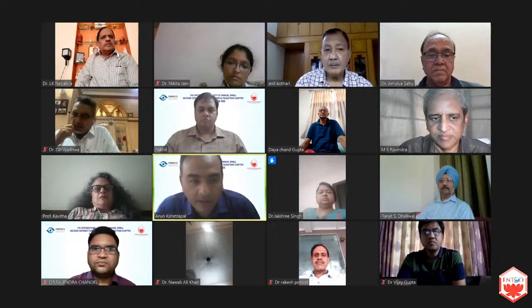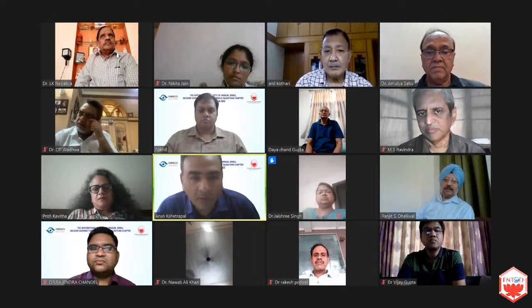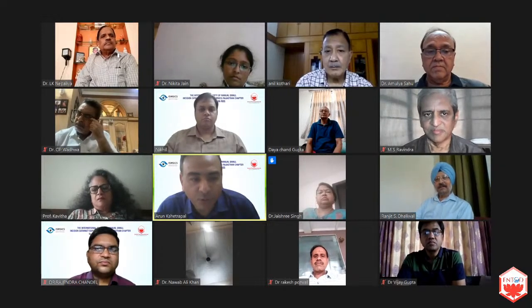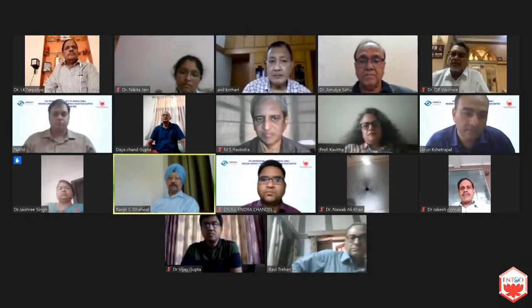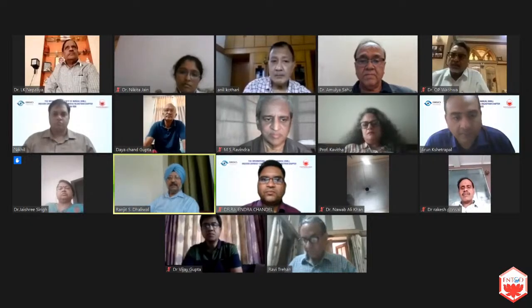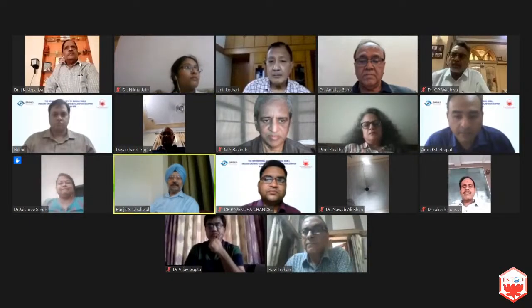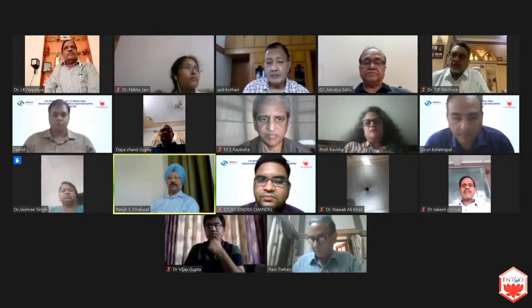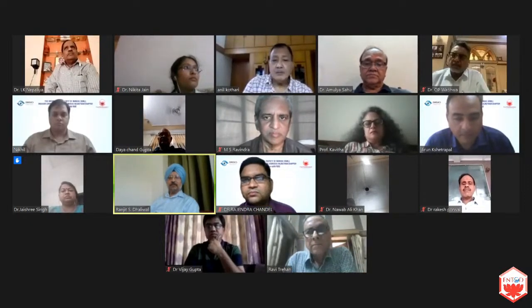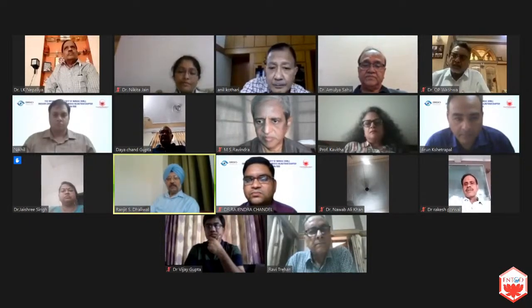Dr. Dhaliwal, you are another friend of temporal incisions. So what about the preoperative keratometry? Do you take them into consideration? Yes, I do take the pre-op keratometry into consideration. All against the rule astigmatism cases are operated temporally. And wherever we want the SIA to be the least, we go temporally, because superiorly, SIA is more in our hands.